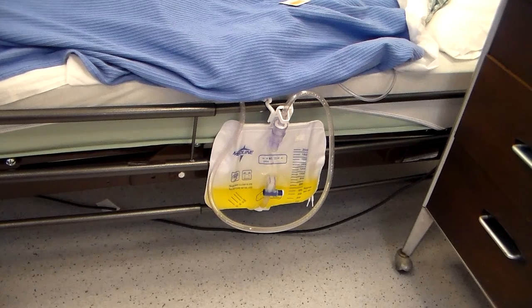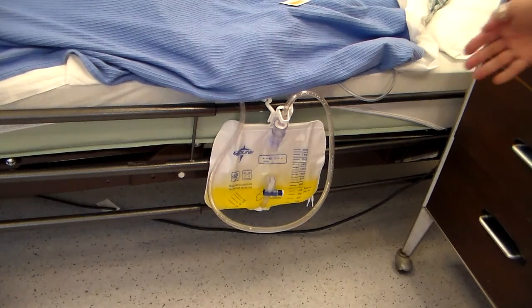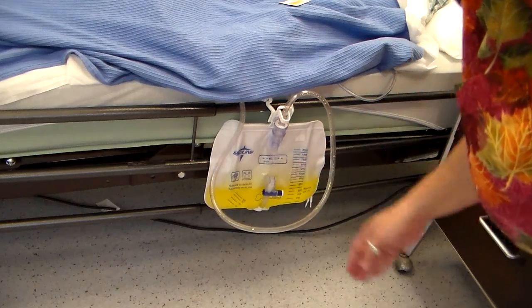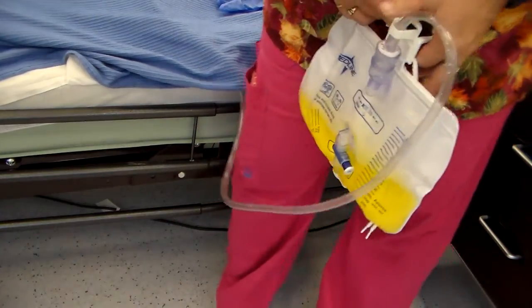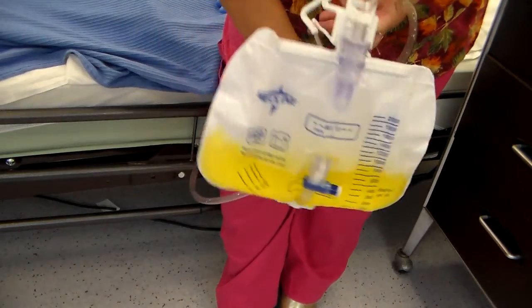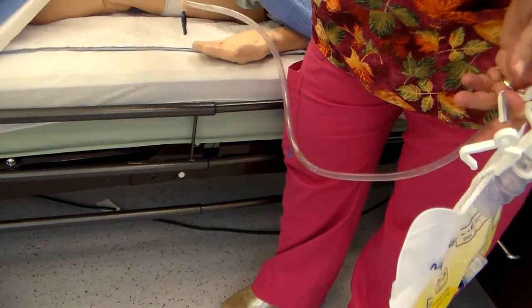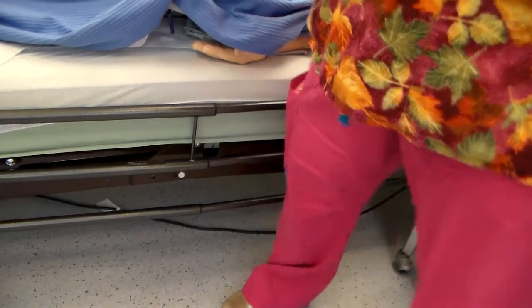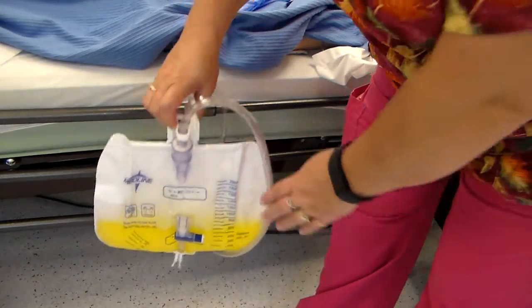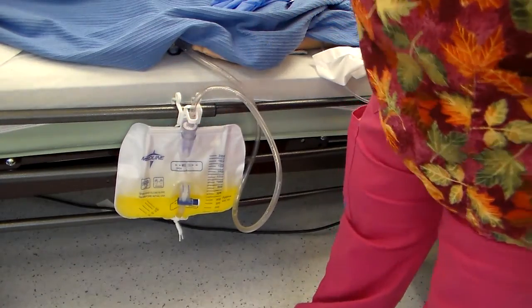Alright, so now we're going to continue with skill 6.16, which is performing catheter care and removal. Right now we're on emptying a collection bag. The collection bag is this Foley here, and as you can see, it has some urine in it. It's just something that urine collects into, and it's connected to the Foley catheter, which is in the patient. You don't want it above the patient. You always want it to be dependent, which means lower than the bladder.